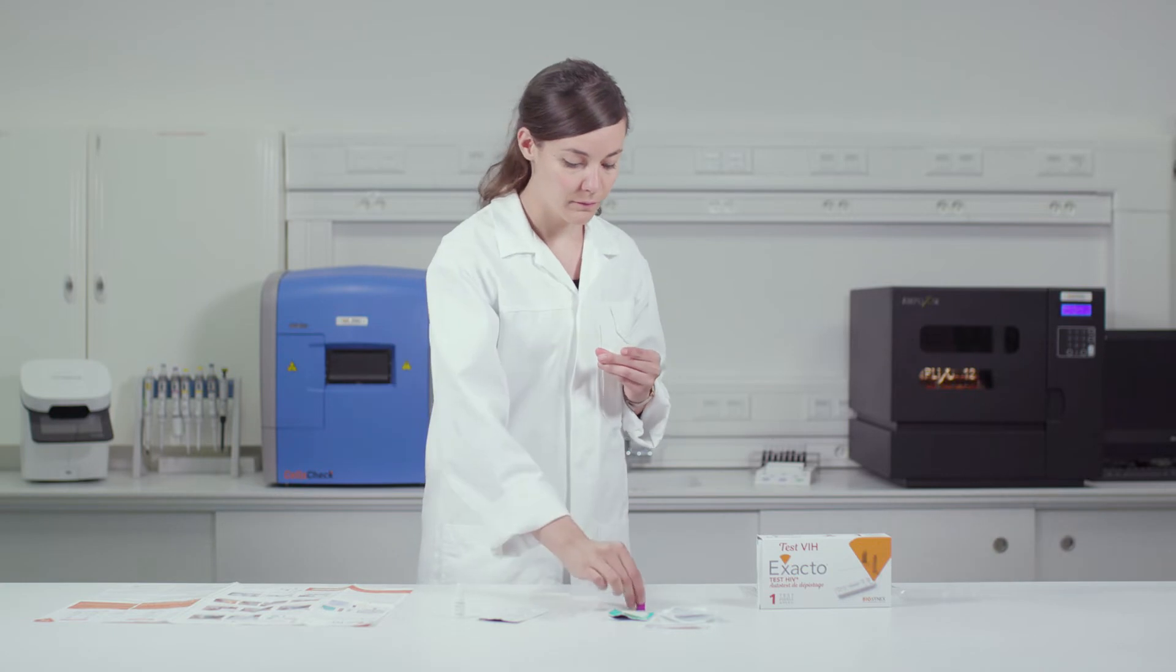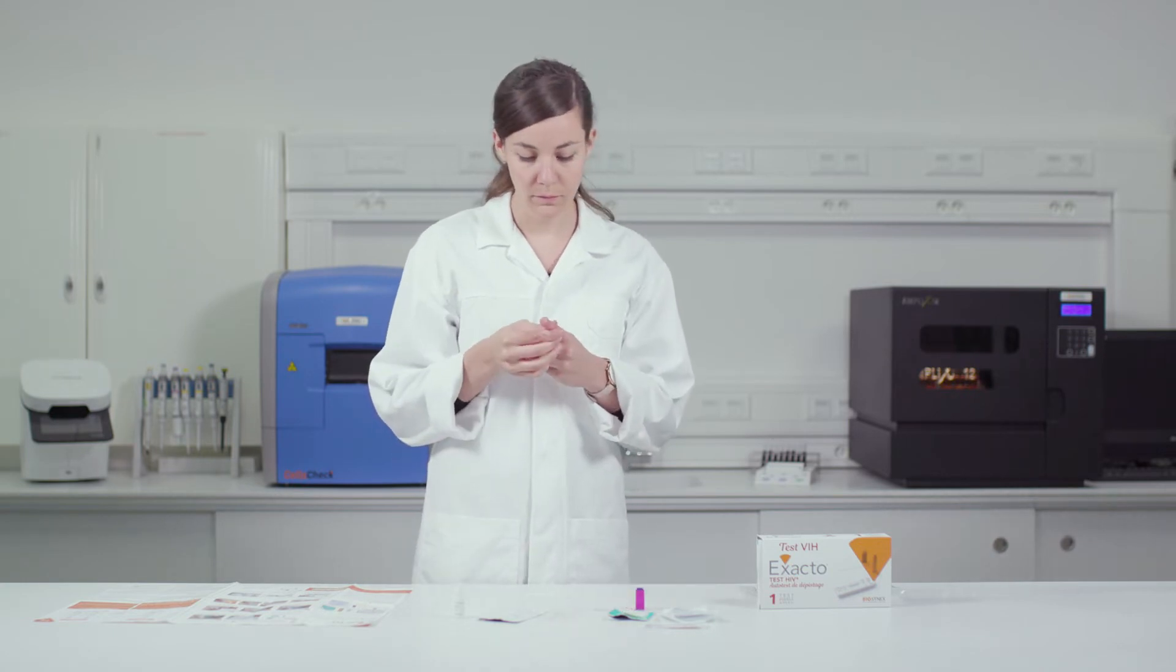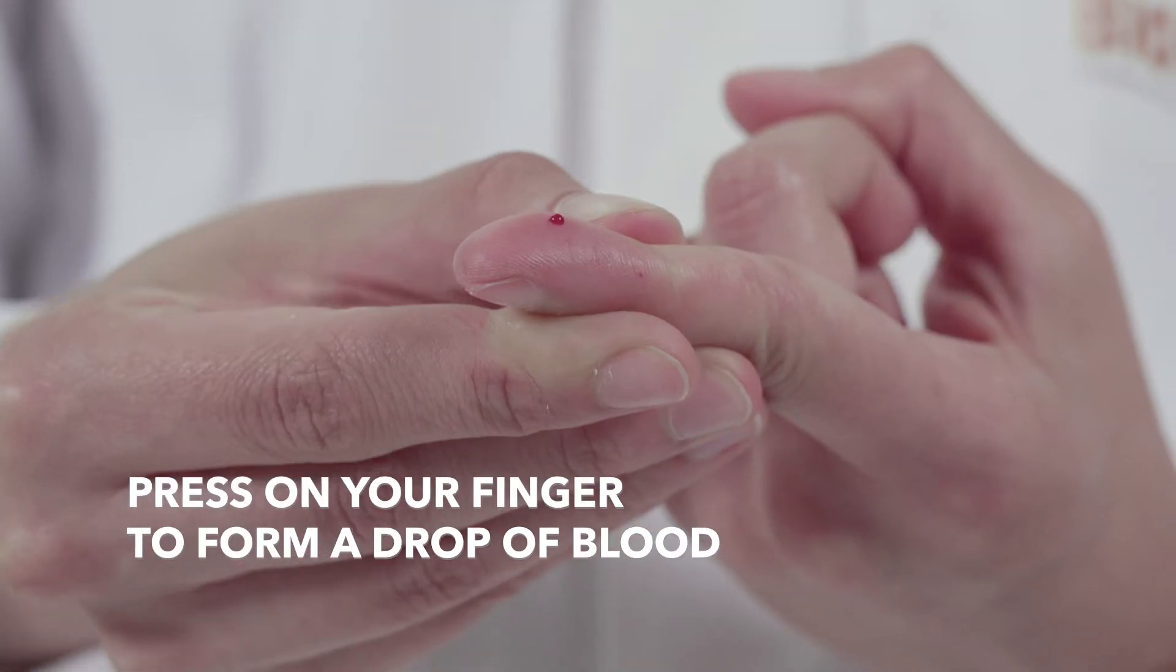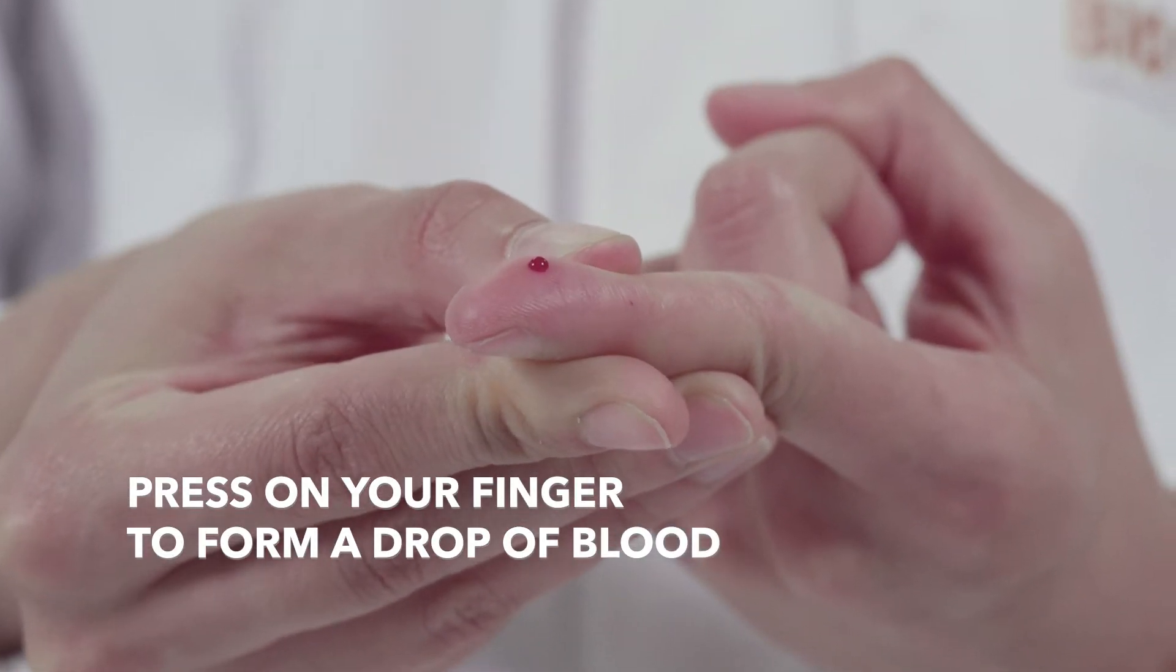To facilitate the sample, prick the side of your finger. There is more blood flow and it is less sensitive. Press on your fingertip so that a large drop of blood forms for the sample.